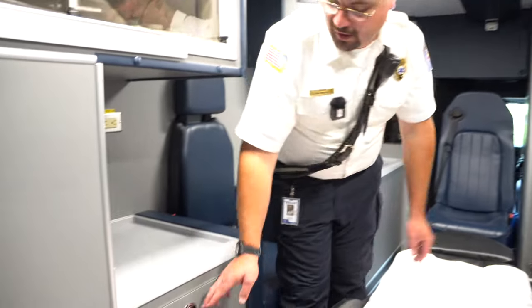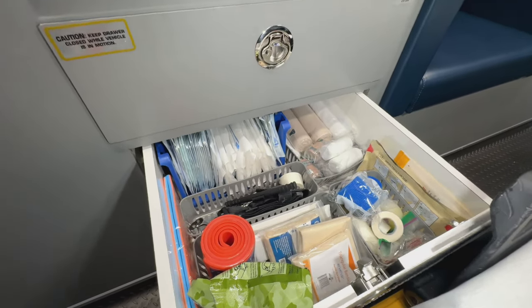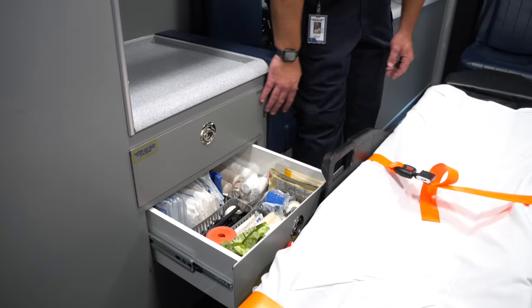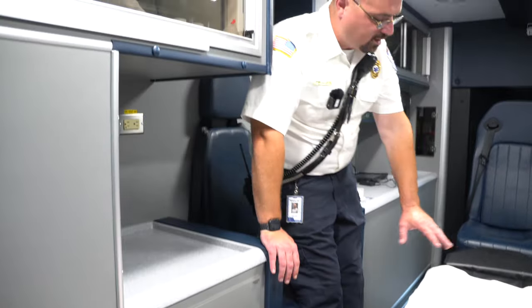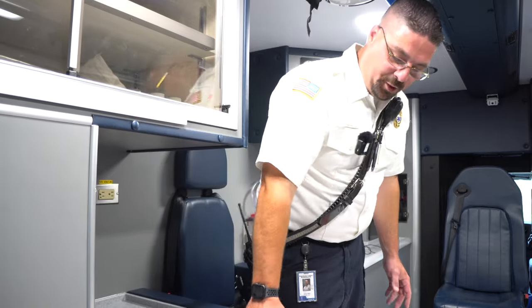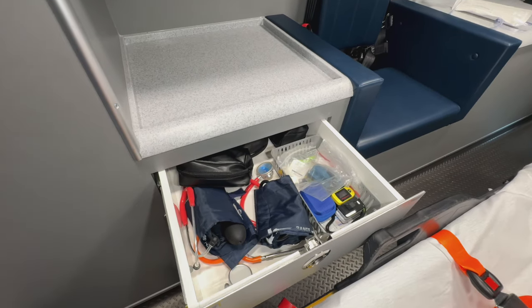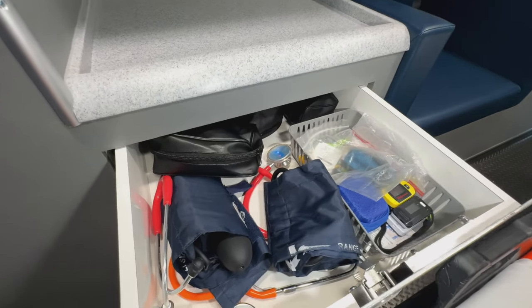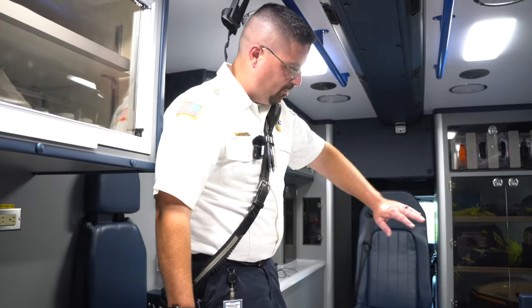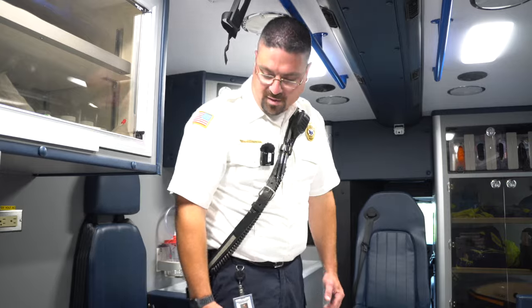Down here is more trauma supplies — the same stuff that's in the bag, just a bigger supply. It's right next to where the EMT works with the patient, so everything is at their fingertips for both airway and trauma. The same compartment setup allows the provider to stay seat-belted and not move around during transport, just reaching for what they need.